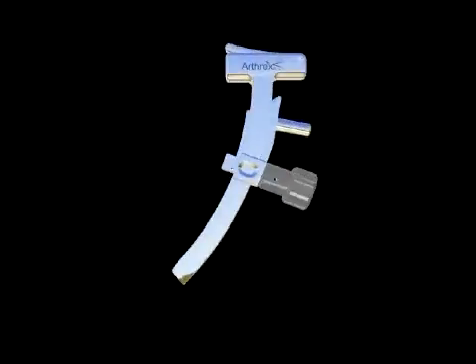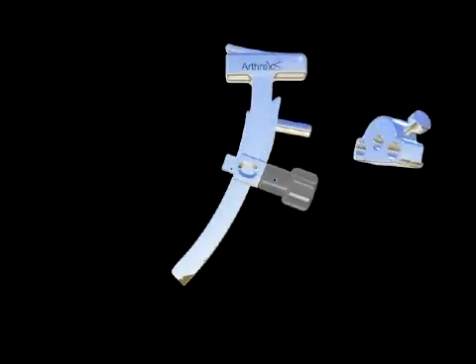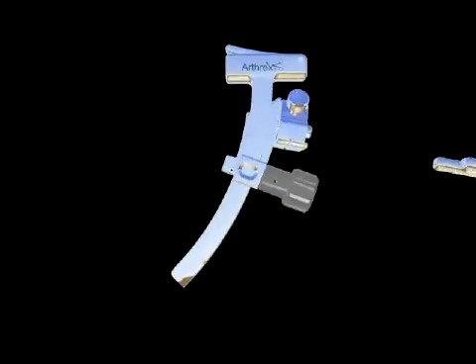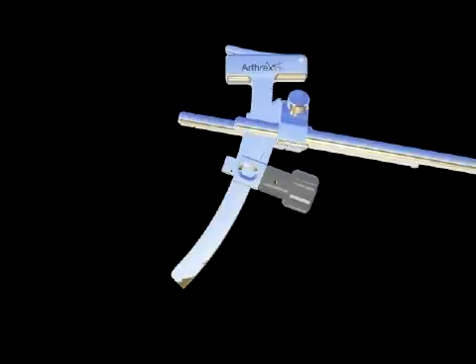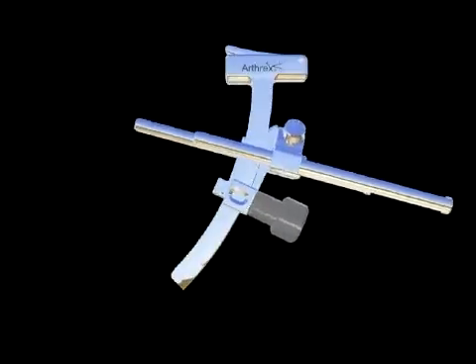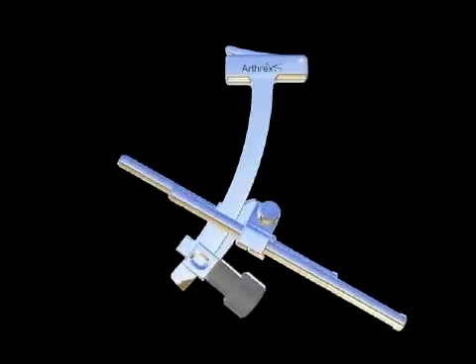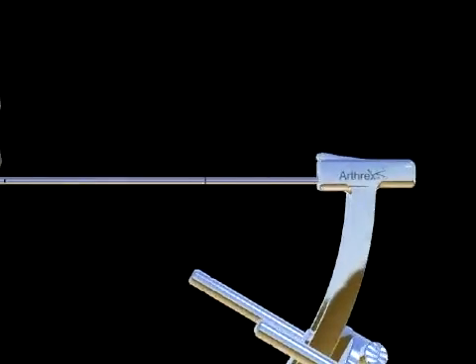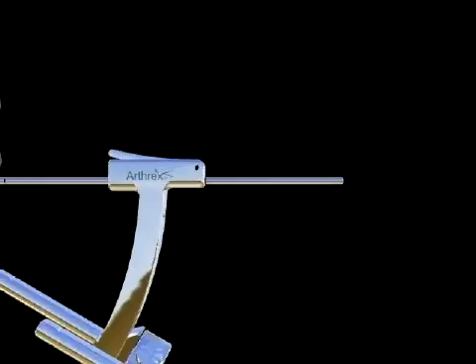The osteotomy guide is assembled by first placing the parallel guide pin sleeve assembly onto the post of the osteotomy guide. The guide pin sleeves are then inserted through the holes of the parallel guide pin sleeve assembly. The angle of guide is set so that the pins enter the tibia and pass through a point cephalad to the superior aspect of the tibial tubercle.